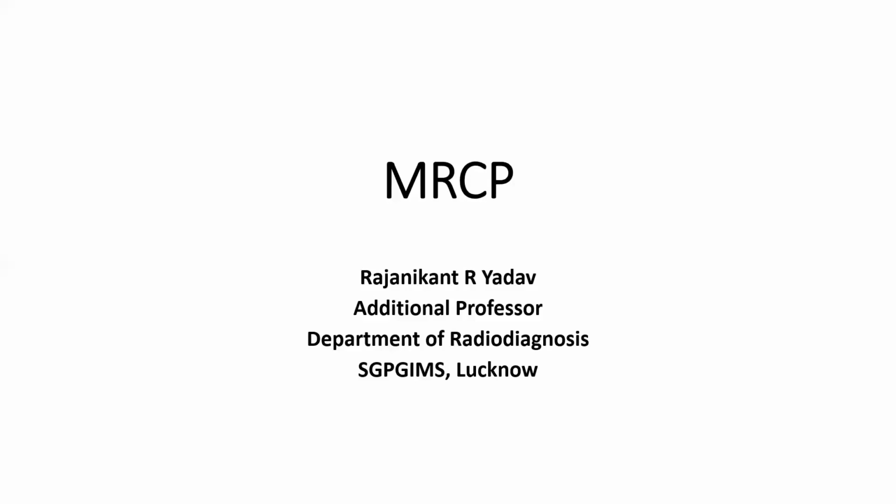Good morning, everyone. My presentation will be on MRCP, and it's basically a primer for residents on how we approach MRCP at our institution.